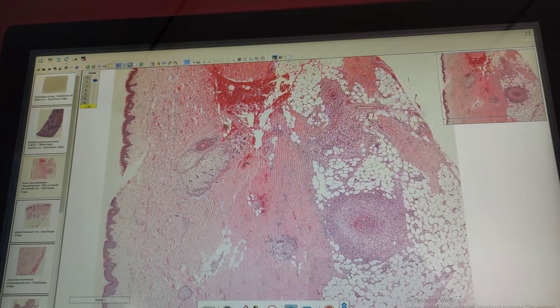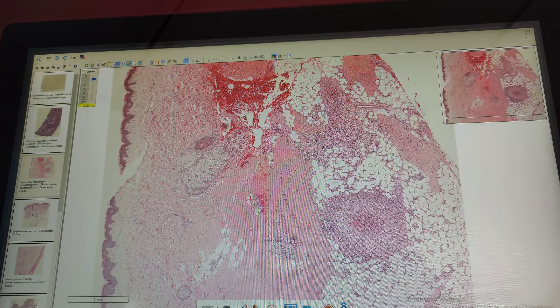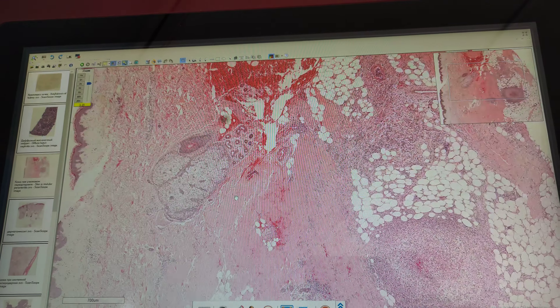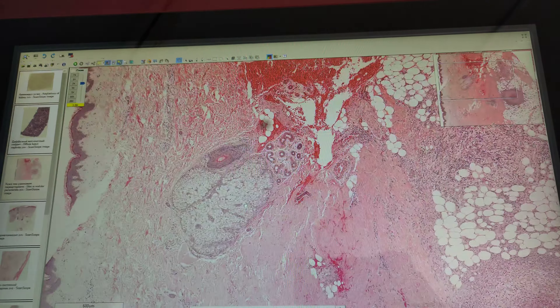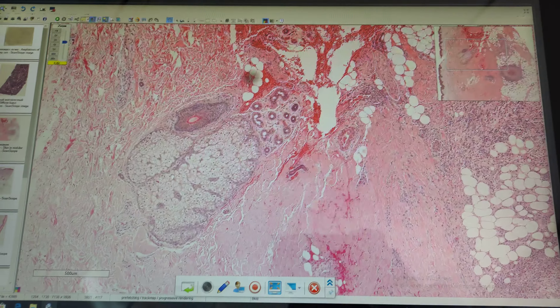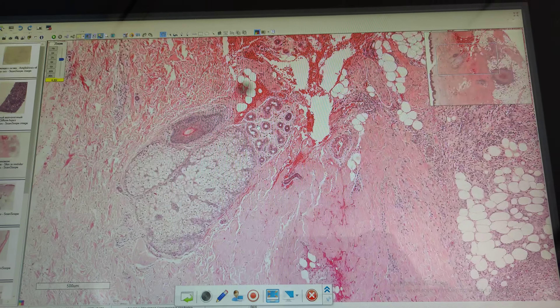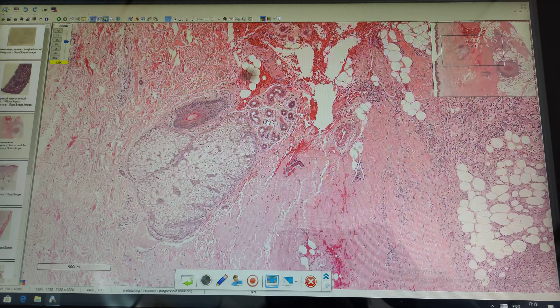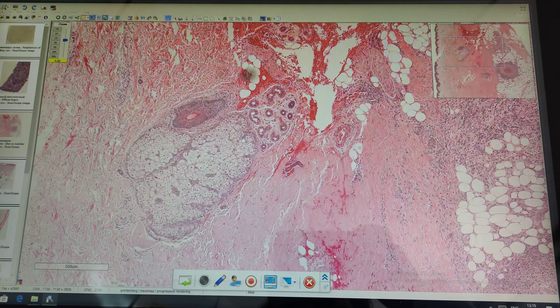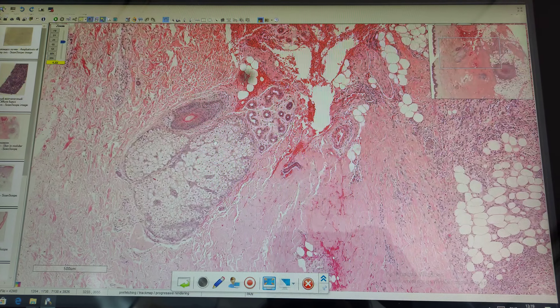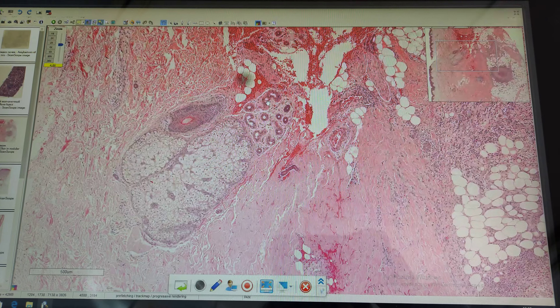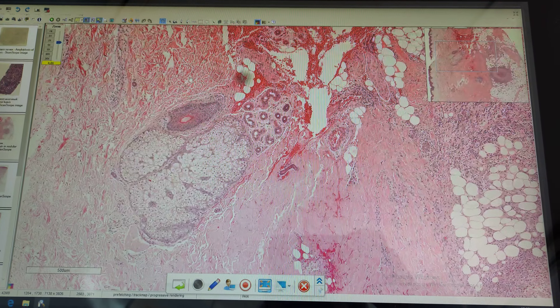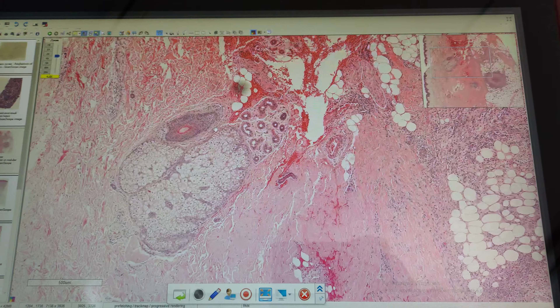In the subcutaneous fat we can detect granuloma. First of all, I would like to remind you that the structures which can be seen in the center are not pathological structures — they are normal derivatives from skin: sebaceous glands, sweat glands, and hair follicles. So these are normal derivatives in the skin.